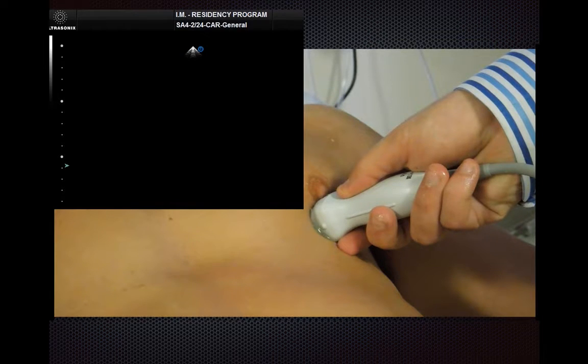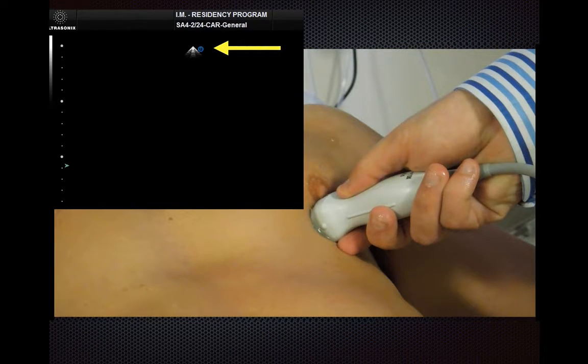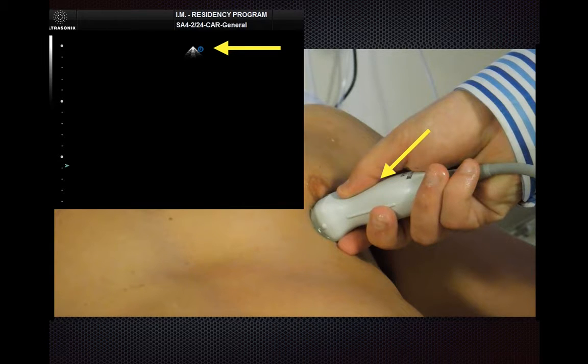If on the other hand you're operating under the cardiac or cardiology convention with the screen marker on the right-hand side of the screen, then you're going to be pointing instead to the patient's left-hand side.